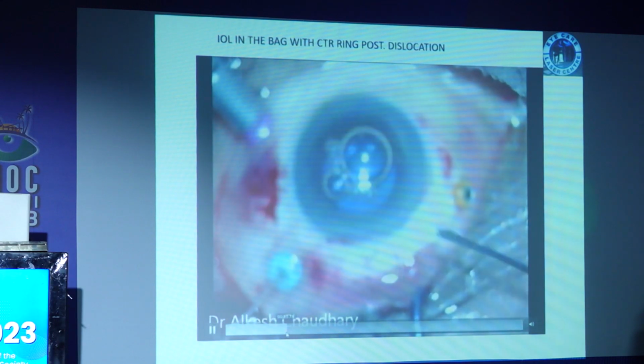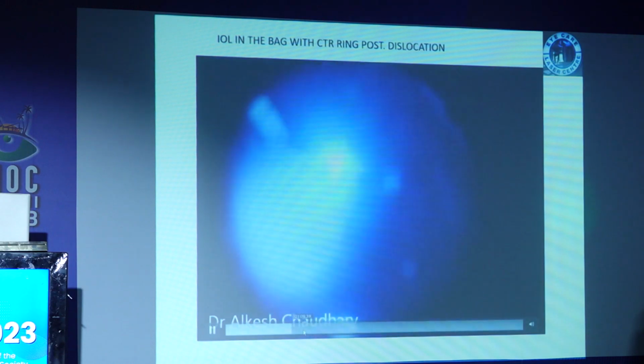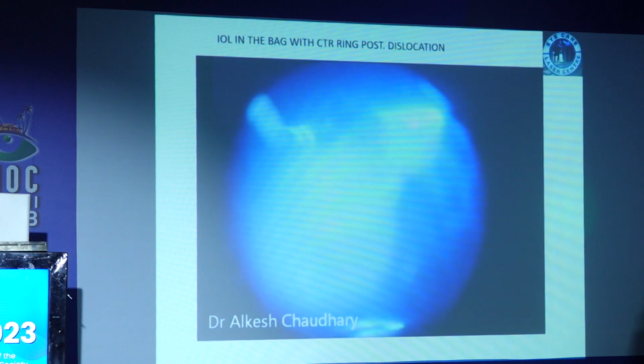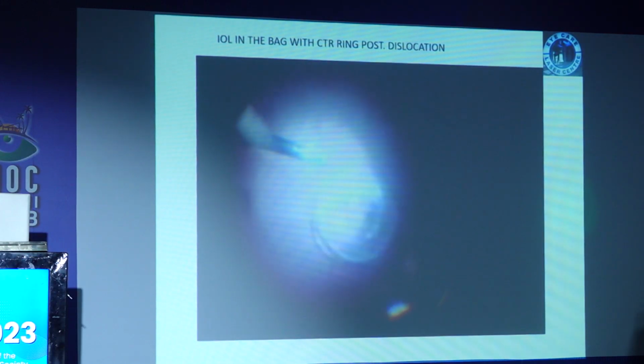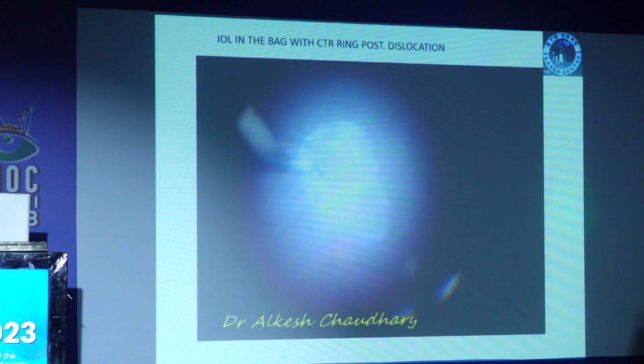and then I went inside making an opening. You see inside, after removing vitreous from the posterior chamber, with the forceps I tried to remove this IOL. It was so slippery because of the capsule ring. So I modified the technique, the fish hook technique.